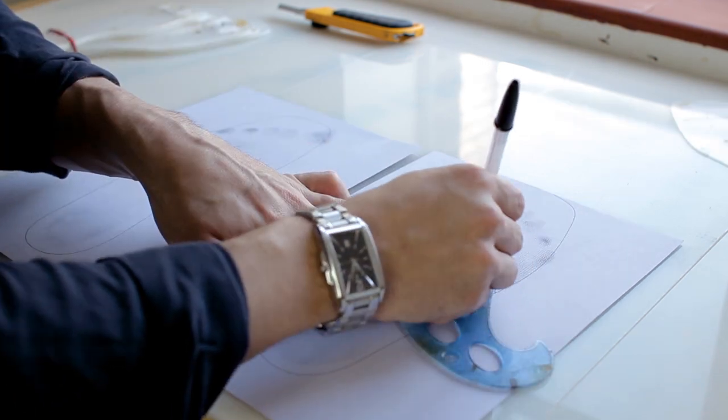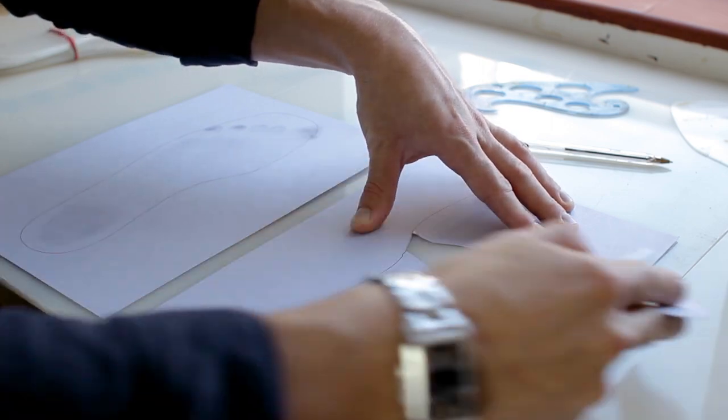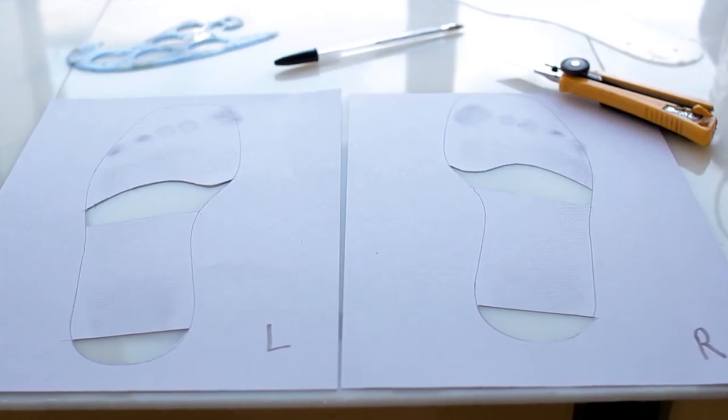Two different feet means two different footprints, creating precise, unique templates from which your orthotics are made.